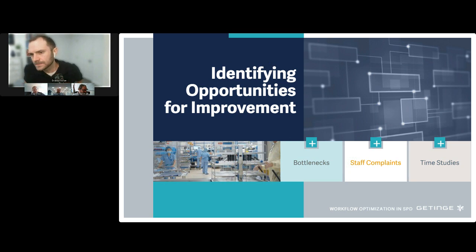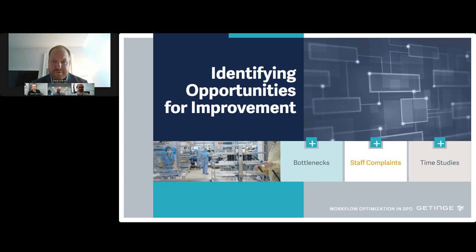No, absolutely. So when you think about what you're monitoring across the board, you have your overall process, from the OR to decontam, but really you start in decontam. As an SPD manager, that's what sets the tone for your department. So if you can start at decontam and identify bottlenecks there, whether it's your staffing model, if you have enough people in decontam, I see often where case carts are just piling up in decontam.